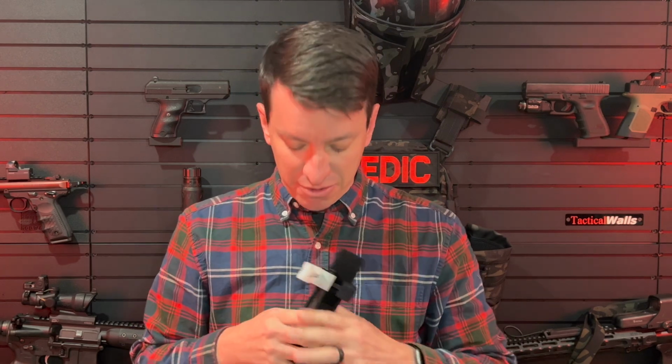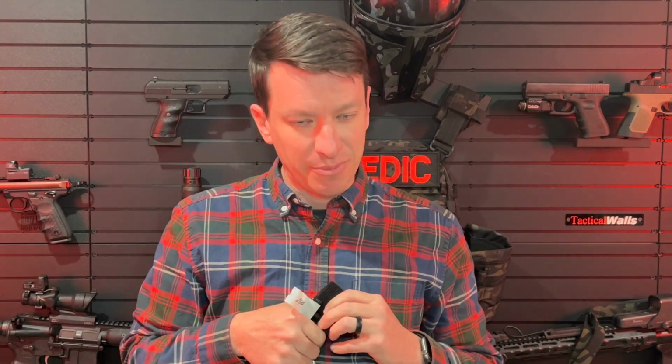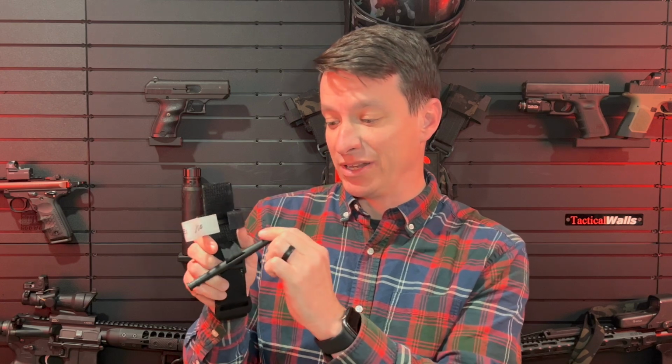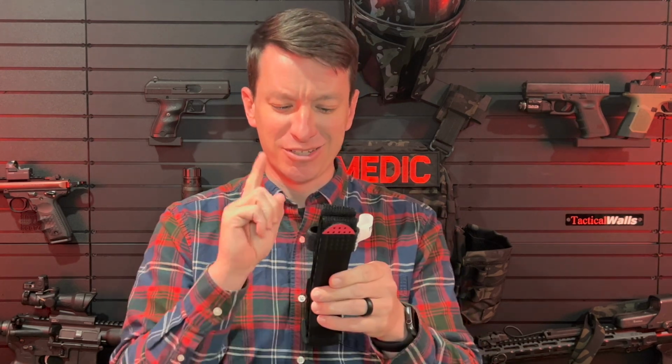We were doing training with the fire department. One of the firefighters had it on his radio strap, and I just kind of saw that part, and I was like, huh, that's interesting. I've got a pretty good eye for tourniquets. I saw the Gen 7 windlass here with the white tab, and I was like, something's wrong with that tourniquet, because the black Gen 7 tourniquets have a gray strap here. The orange ones do have a white, but that's a problem. So I was like, let me borrow that just for a second. Let me see this first.